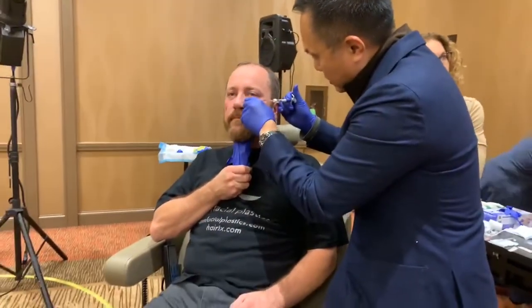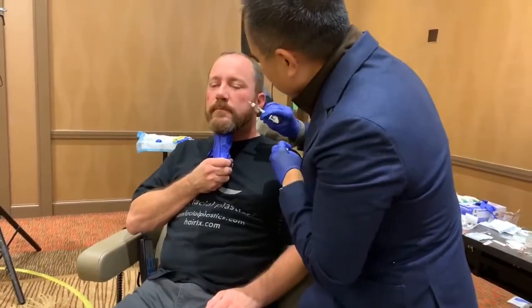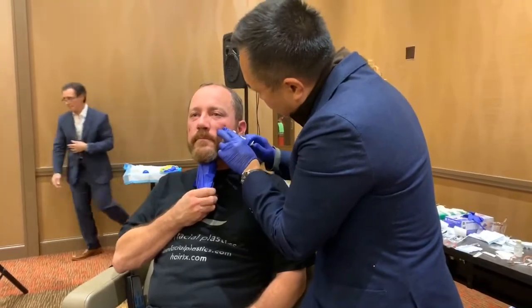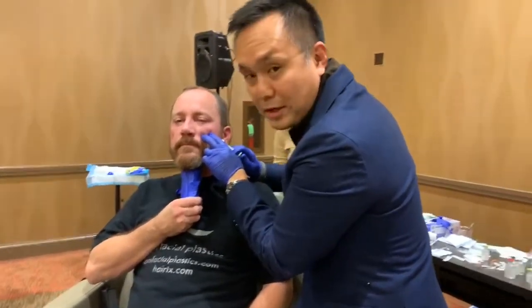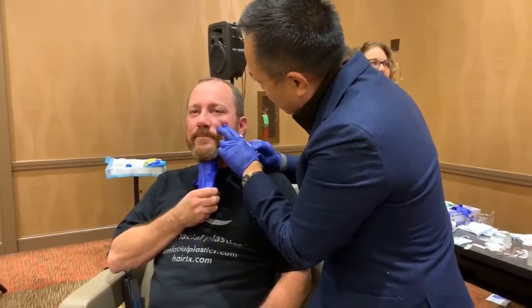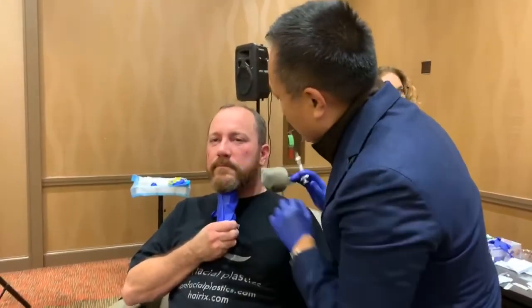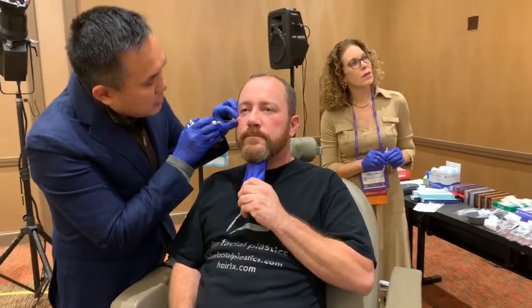Looking at this on the fly — Billy's got a very long longitudinal tear trough and I feel like I'll fill this better from a horizontal perspective. I see a little deficit there, so we're just going to go back and nudge that. It should be a little more numb since the Restylane is already there. We've already done a lot here so most of this is probably edema, but we're just going to touch it up just a little bit.